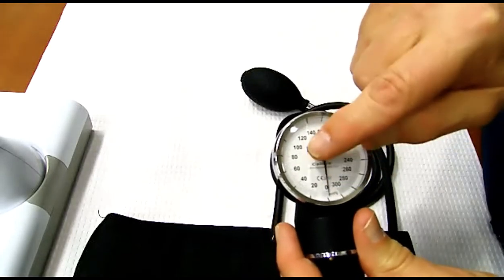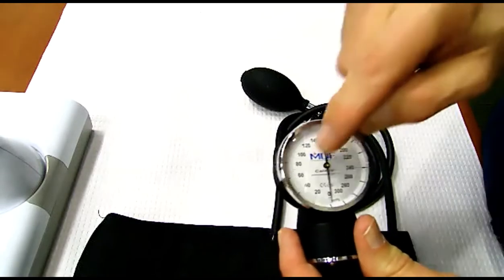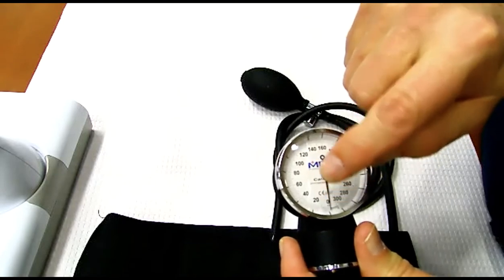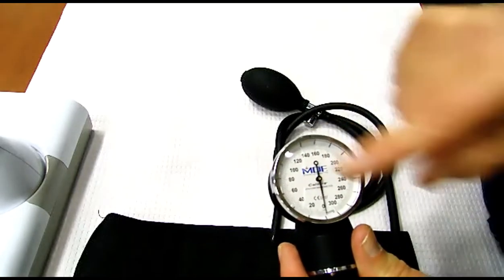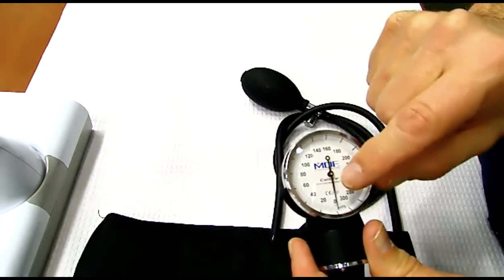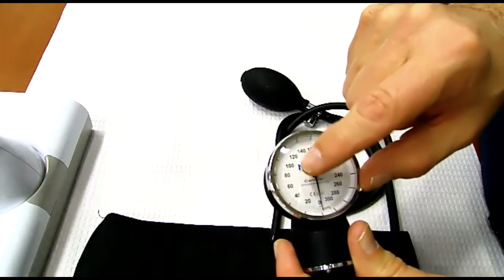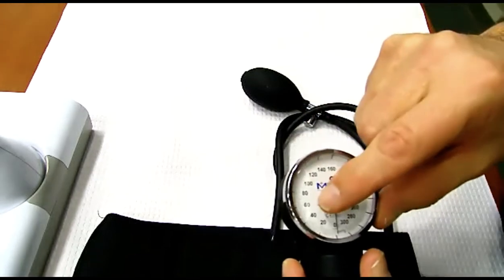Well, between the 40 and the 60, can you see halfway between those two, there is a larger notch? And that larger notch halfway between the 40 and the 60 is going to be essentially the 50. It's 10 millimeters of mercury. So halfway between two sets of numbers, you're going to have the value in between. So truly, there goes 20, 30, 40, 50, 60, where the odd tens are the ones halfway between the two with a large notch.